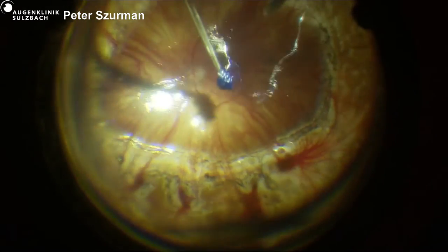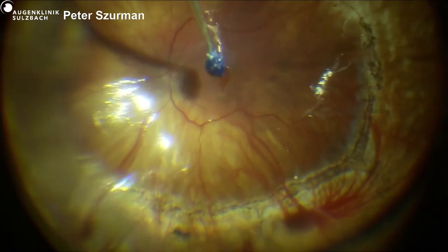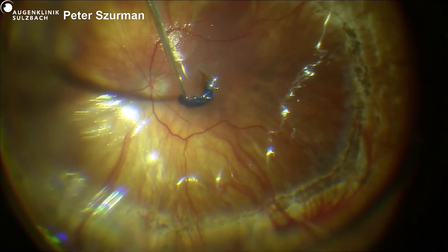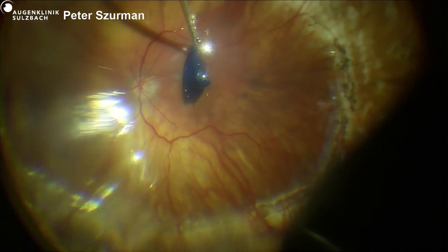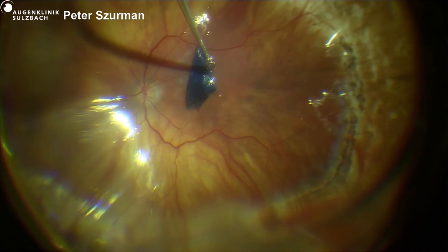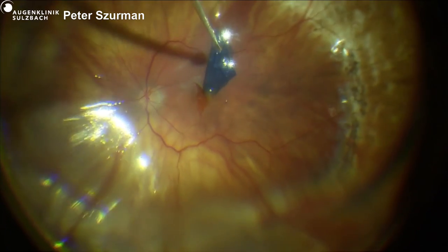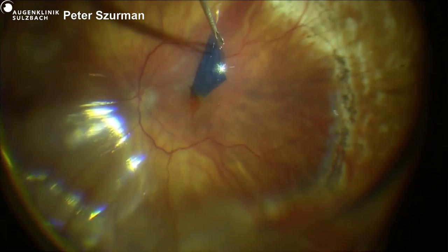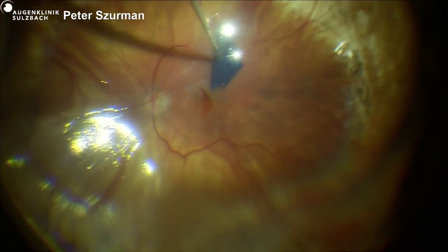So Peter, I agree with everything that's being said. Very sophisticated discussion. But since you have peeled the ILM, what about a chance of just doing face-down positioning with tamponade and no patch? I mean, yes, it might fail. But if it closes, like a normal macular hole, you win big. You don't have any material there. What do you think of that? Is it completely crazy? You can say yes, because both Grazia and Klaus think I'm completely crazy. But what about a try of tamponade with prolonged face-down positioning for this break, now that you've relieved the ILM? Yeah, it's not crazy at all.